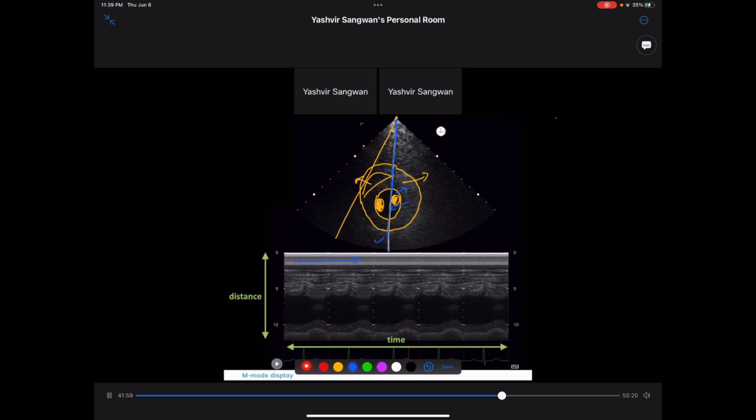Okay? And now there is some guesstimation to take place. So let's see, the anterior wall of your left ventricle is around 1, 2, 3, 4, 5, 6, 7 centimeters. So I'm thinking that this is then the anterior wall of your left ventricle. Okay?